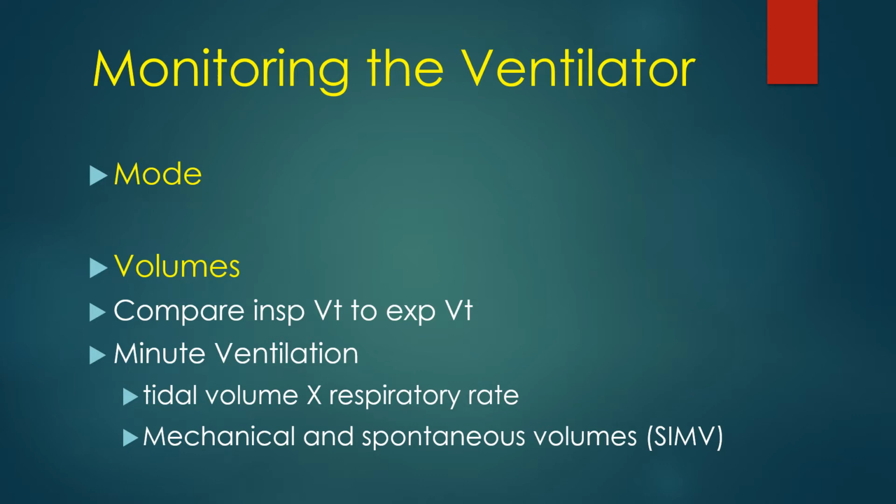On the expiratory side, the patient exhales humidified warm air into the ventilator. And there should be an expiratory filter, and that will get some of the moisture out. Some expiratory filters on some ventilators are heated so that it's pretty much dry air, or much drier air going back into the machine. But that moist air can affect the expiratory transducer and have it tell you something that's incorrect, that the tidal volume is more than what it really is. Anyway, again, you got to be a detective.